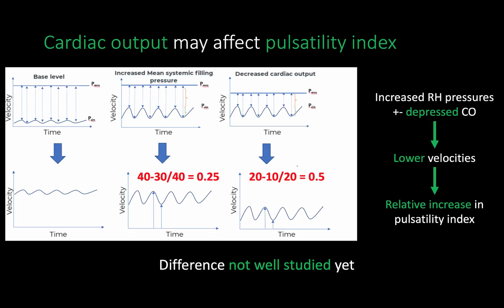Venous pressure variations during the cardiac cycle might not be the only hemodynamic factor influencing portal flow pulsatility. During observational studies, we observed an association with cardiac index. Low cardiac output from worsening left or right cardiac dysfunction can exacerbate pulsatile flow by decreasing mean splanchnic filling pressure.